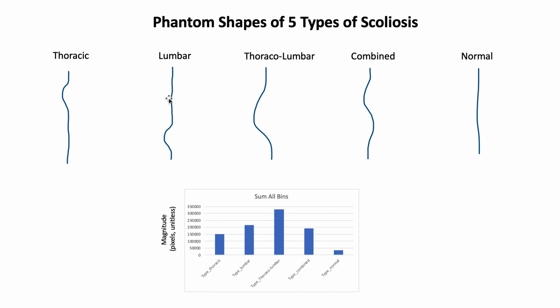And that's the power of the LCPC transform. It can quantify very precisely very subtle differences in shape. And these shapes would not be detected robustly by measuring area or volume.